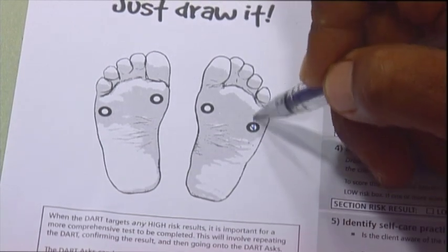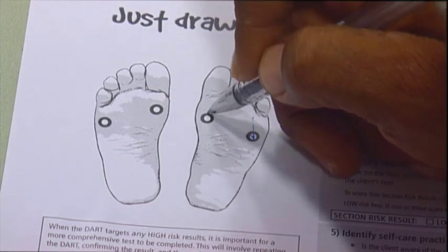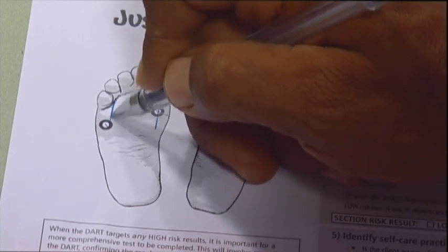Tick the circled targets if the person senses the monofilament. Cross the circled target if the person does not sense the monofilament.